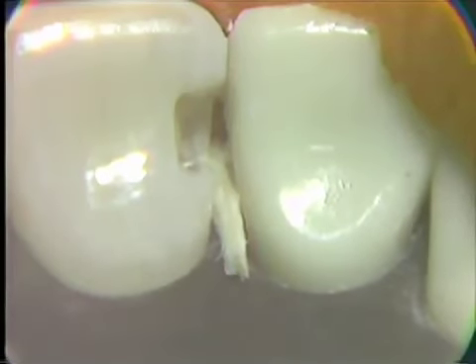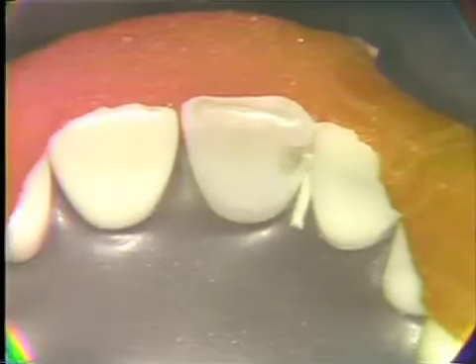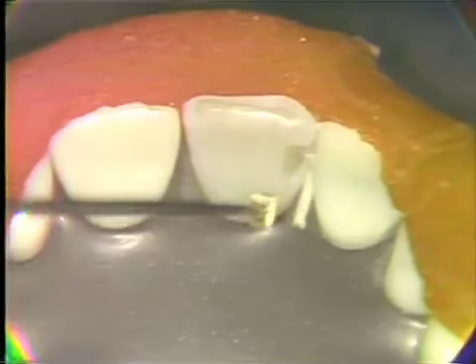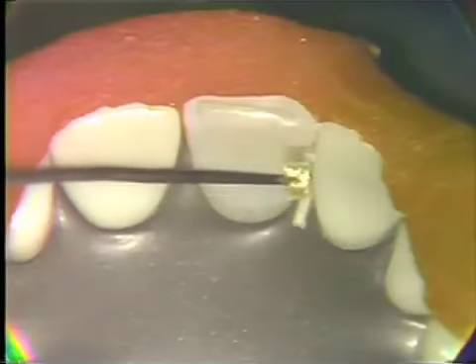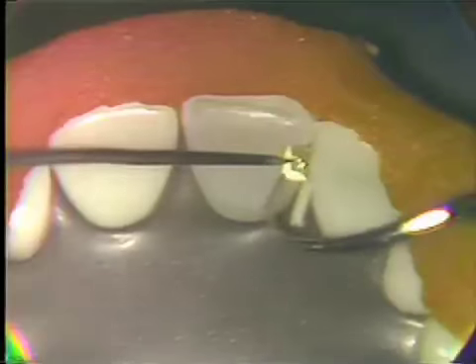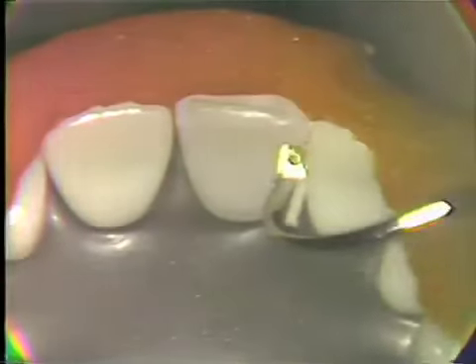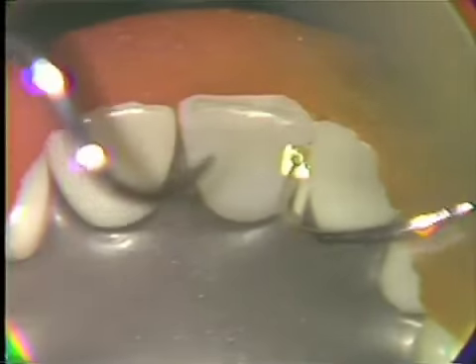So we'll begin then with a piece of the annealed cohesive gold. Going to be making the application of this into the cervical position and begin the condensation with the condensing instrument.